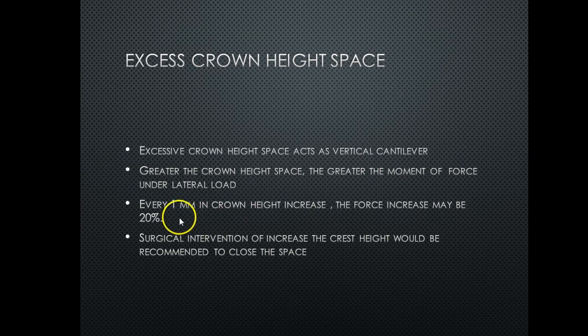And it shows that for every millimeter in crown height that increases, the force increase may be about 20%. So that's a lot of torque force that's going to affect the placement of the prosthetic and dislodgement, and the implant itself, which can relate to crestal bone loss because it'll be traumatically putting force on the implant area, at the crestal area.